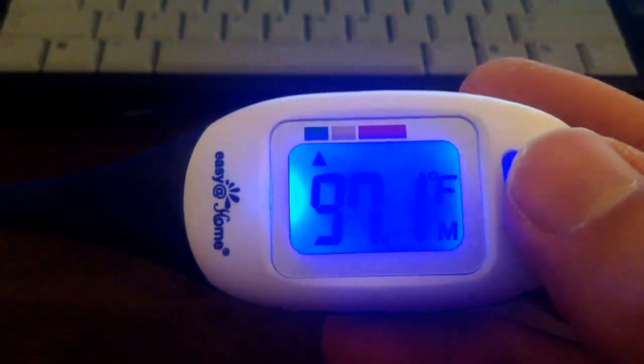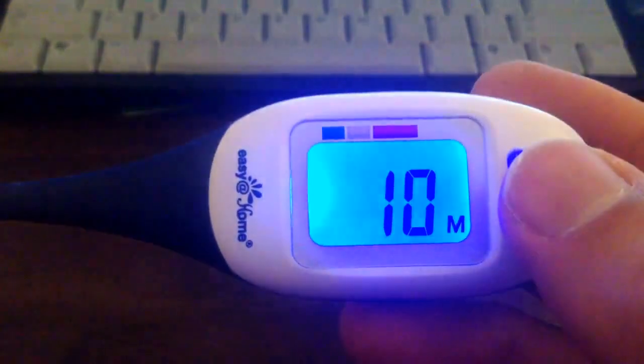This thermometer stores up to 10 readings. I found out that if you have less than 10, you see a dashed line instead. I want to point out that the memory mode can only be accessed after a measuring, not by simply turning on the thermometer.